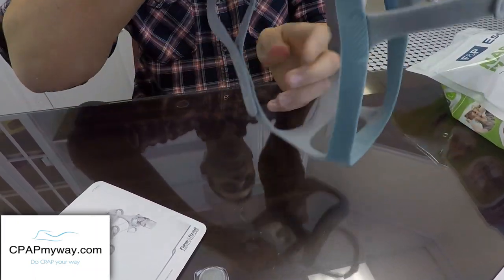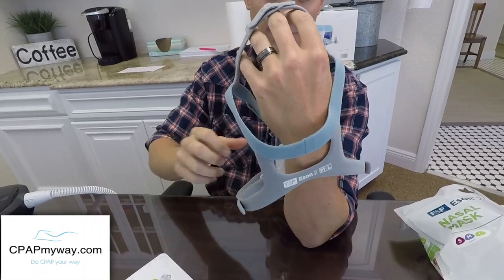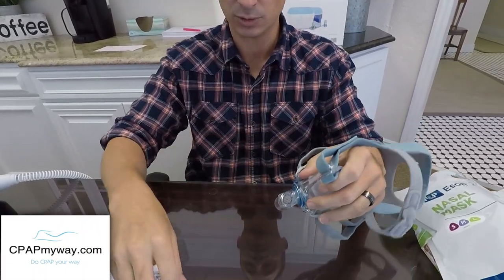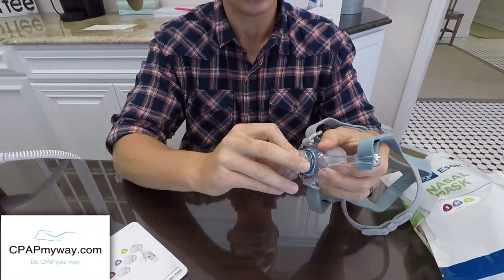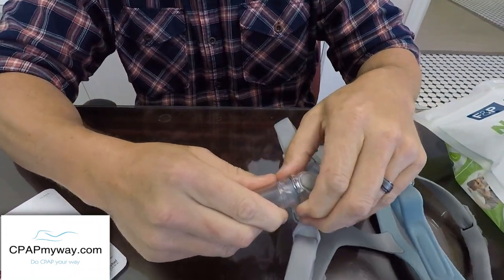If it doesn't, you probably have it upside down or inside out. You should always have the logo on the back bottom of the head strap. And then, of course, your diffuser snaps right back onto the front just like that. Real simple.